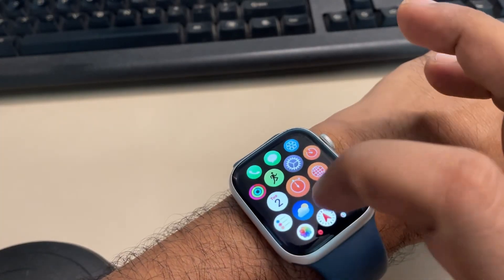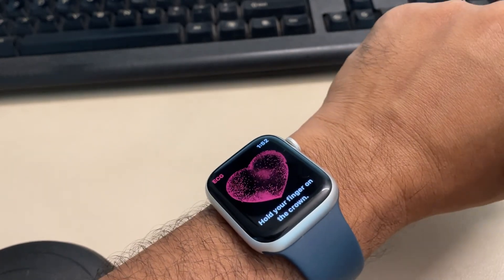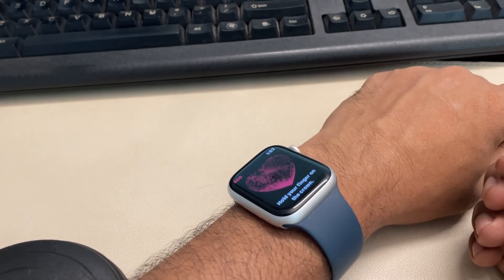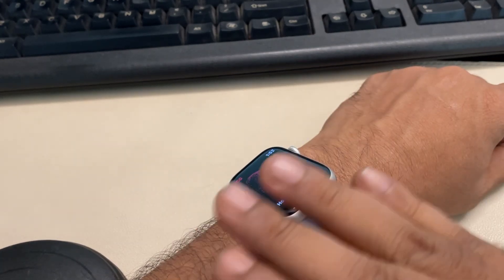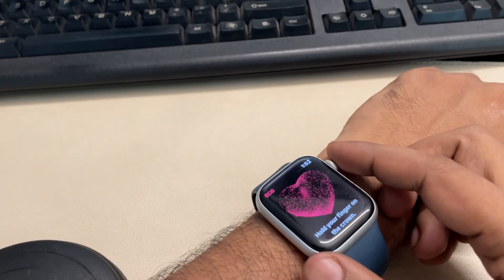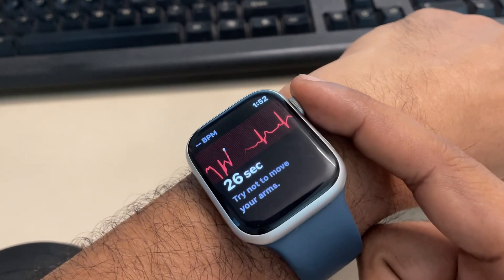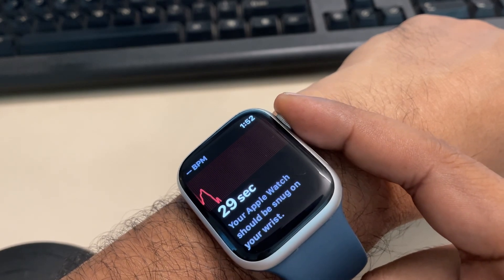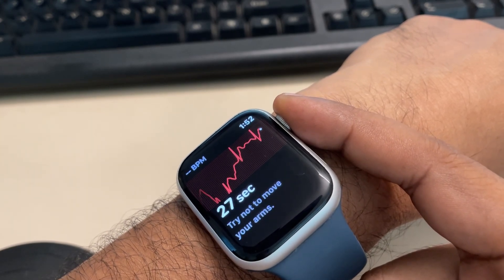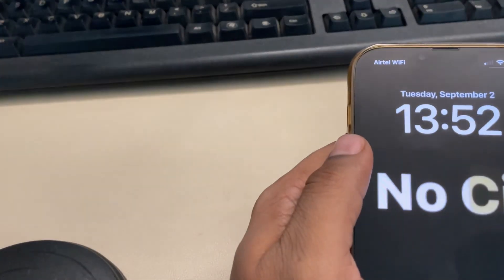If the ECG app is not working on your Apple Watch, here's how to fix it. First, place your hand on a flat surface and keep it still. Try taking an ECG — the key thing to note is do not push too hard and not too softly, press gently. It will then start the ECG process. If this does not work, let's move to another method.